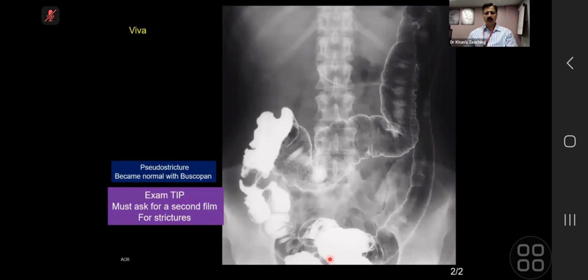The examiner is going to guide you. That's a rule in barium, because with things like linitis plastica in the stomach, you can make a fool out of yourself, since at that point it was underdistended.